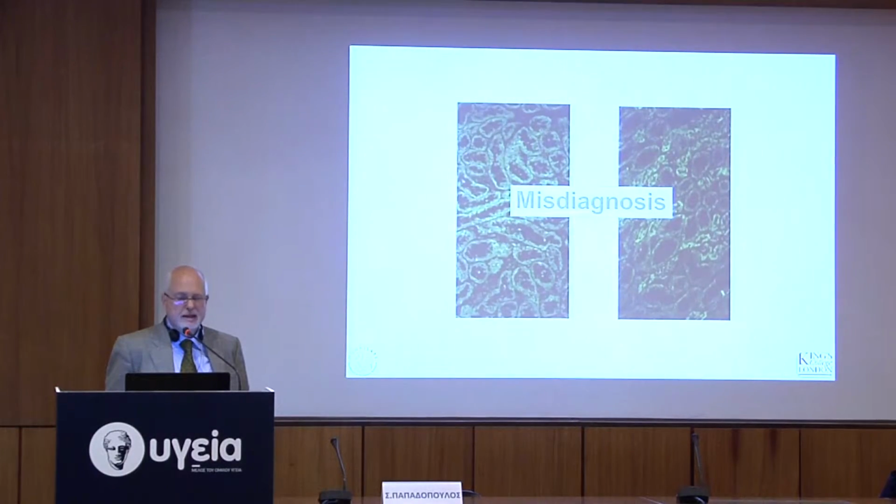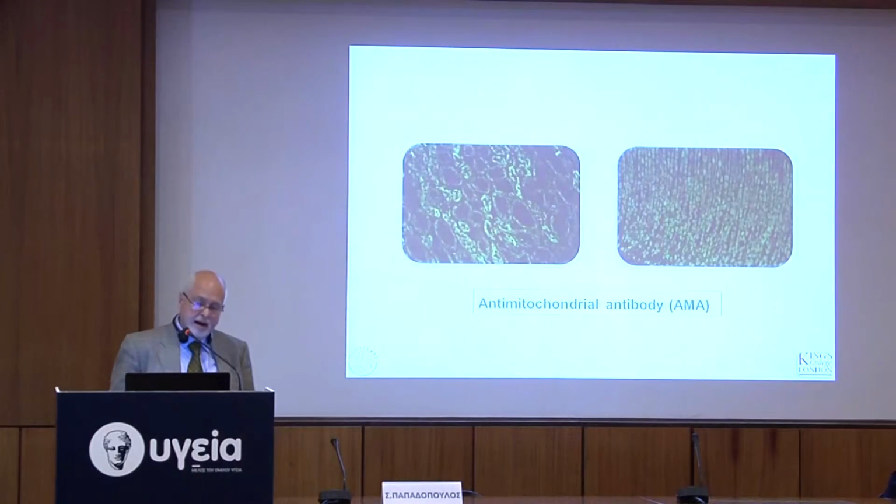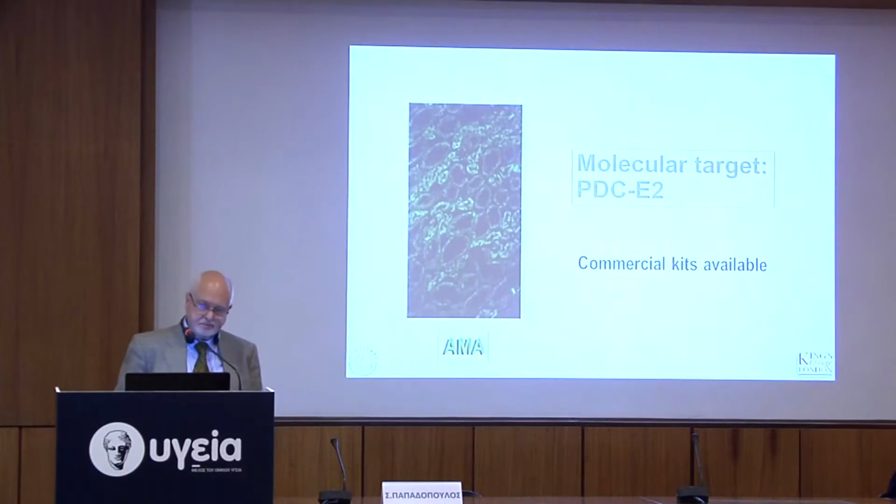If you look at the right, you see that the smaller tubules reaching mitochondria are more stained to the right, but you need to have a good eye. So you could make the differential diagnosis using the kidney only, but that is not the thing to do. What you should do is add a stomach of the rat. The antimitochondria stains the stomach, the liver, kidney; microsoma not. So if you have another tissue, the diagnosis is immediately made, and you don't make the mistake that was made in Chicago.